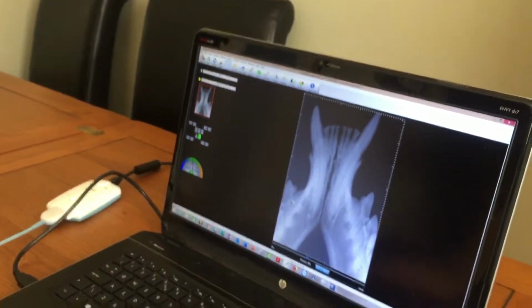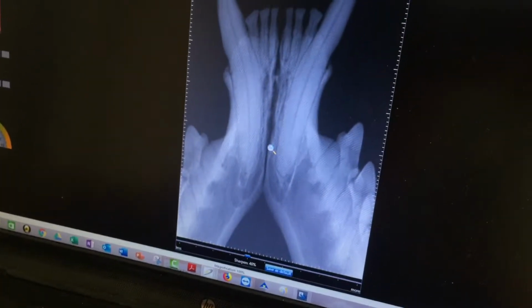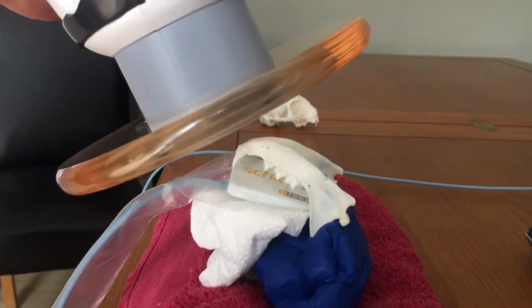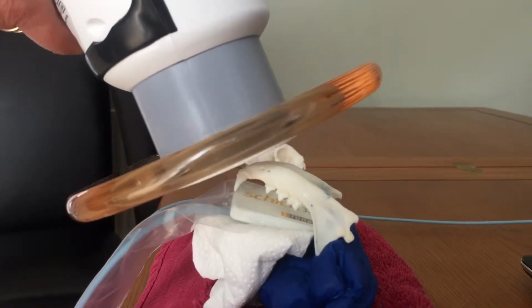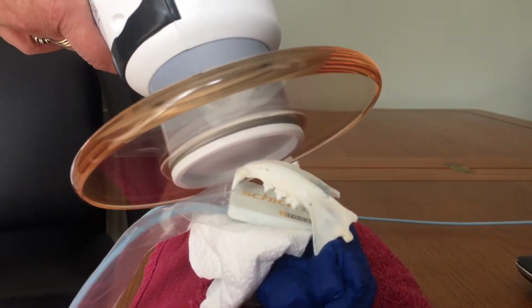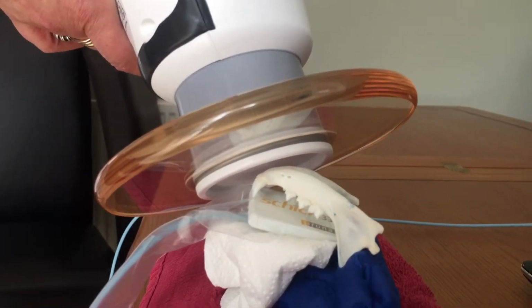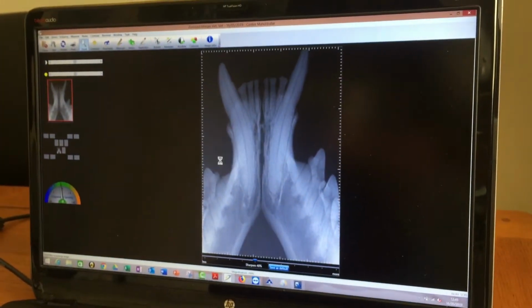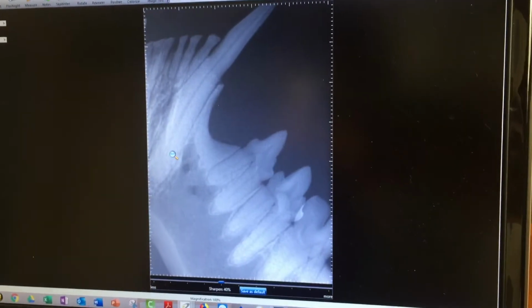Now this premolar here is often the one that's a problem in cats. So we want to get a nice clear image of that. So the way we're going to do that is leave the sensor exactly where it is. We started off at 70 degrees here. So all you would do is leave everything as it is and just go slightly over and point at that premolar and take your image. It'll come up on the screen. There you go, so you see that premolar nice and clearly there.